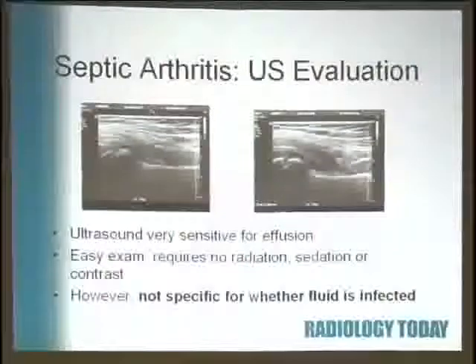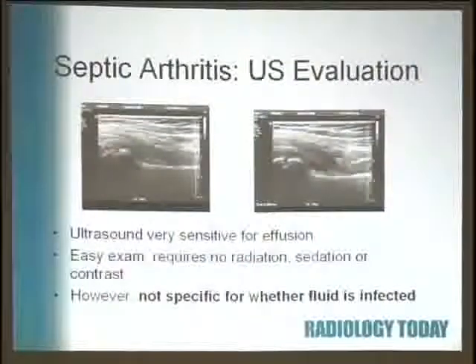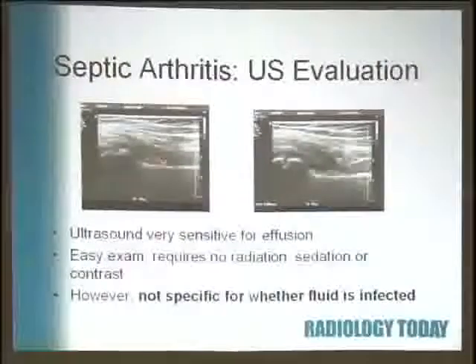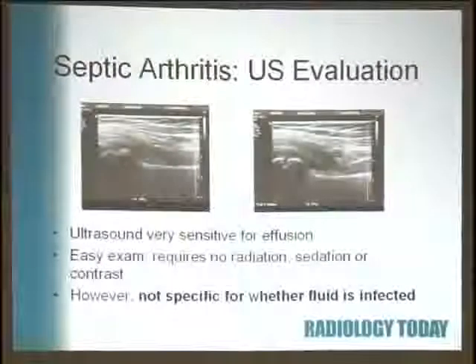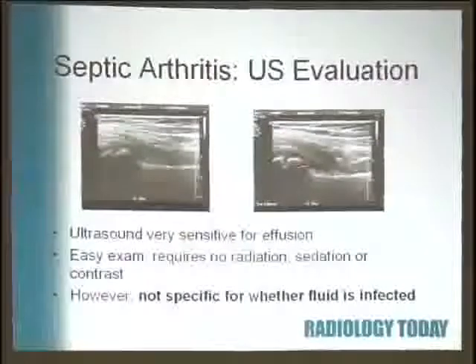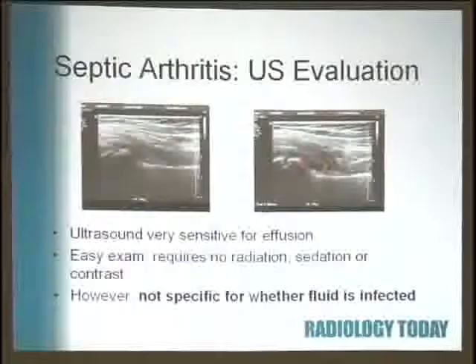I'm standing, this is their skin, I'm looking down, so here's their epiphysis, then the metaphysis, and then this is the long shaft of the femur. And here's the normal joint capsule that reflects back on itself, but it's collapsed because it's basically empty. There's always a trace of fluid, but it's basically empty. On the other side, boop, it's popped open because there's fluid in there.